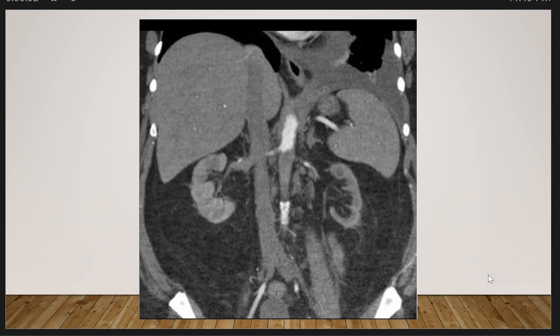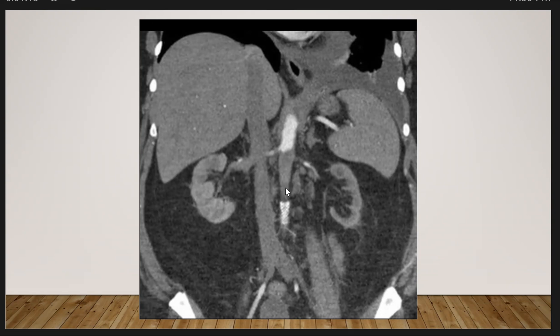This is a short case discussion. As we see in this abdominal CT scan on a reconstruction review, at the level of the renal arteries, below the level of the renal arteries, we have atherosclerotic occlusion of the distal aorta.